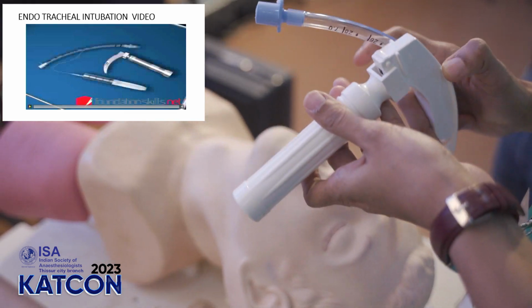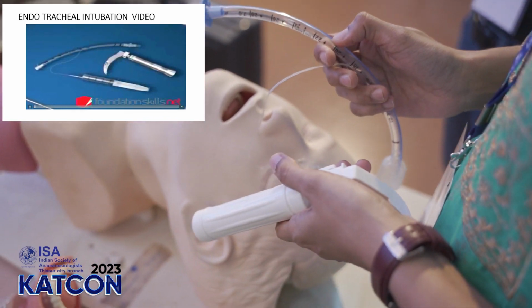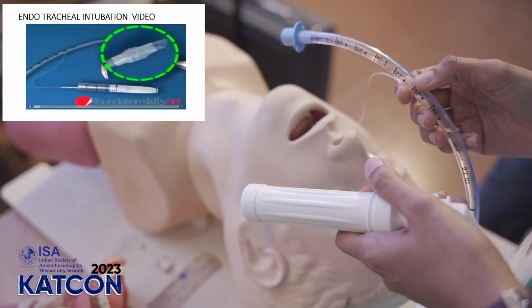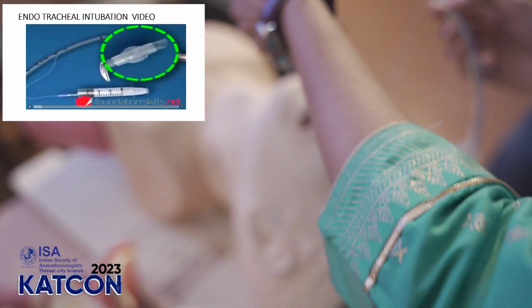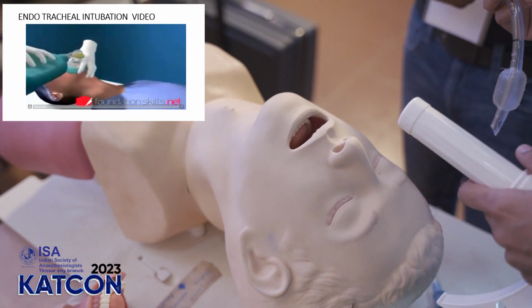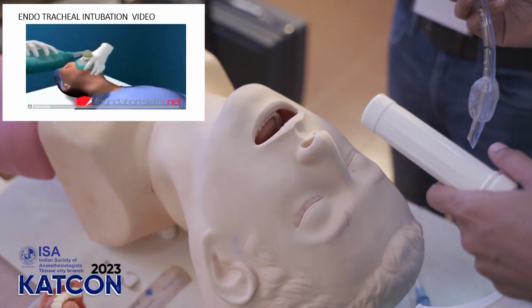So this is a video of an endotracheal intubation. Ensure that the equipment is prepared and check that the laryngoscope is working and the cuff on the tube inflates and deflates properly. Pre-oxygenate the patient with bag and mask ventilation for up to 1 minute before attempting to intubate. First, we'll be doing a bag and mask ventilation.